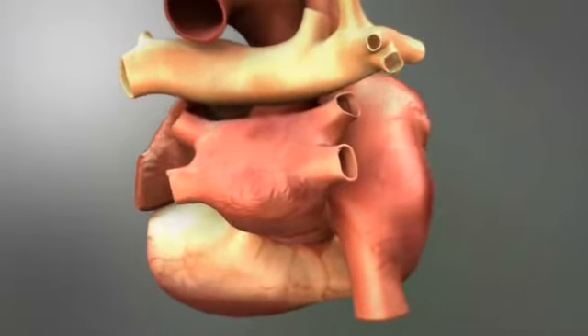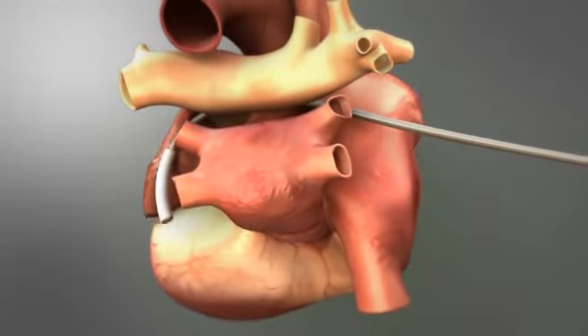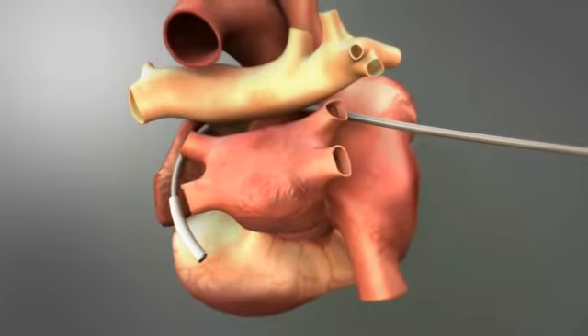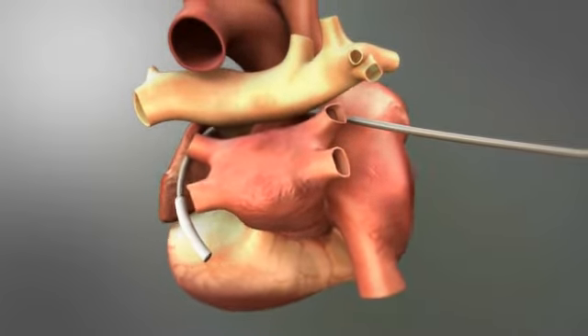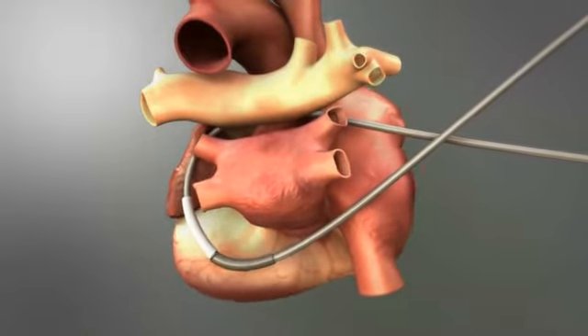The COBRA fusion magnetic introducer is inserted into the transverse sinus as a guide catheter in preparation for routing. The magnetic retriever is introduced into the oblique sinus, and the magnets naturally connect into place.